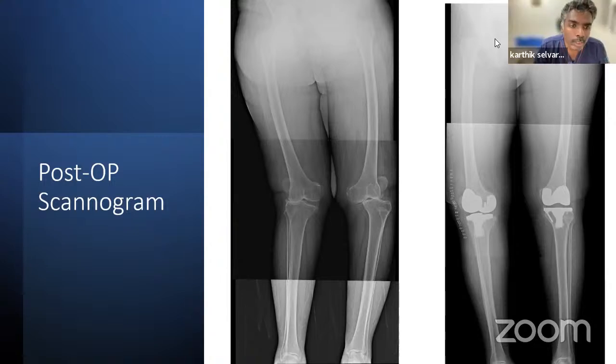You don't need to worry about torsion in tibia. I think we need not bother too much unless it is very severe. As I said, in varus, the torsional deformities will be less. You may have some tibia vara, but in valgus and some of the dysplastic valgus, there is a significant torsional deformity between proximal tibia and distal tibia. There is definite rotational deformity there. In those cases, you have a little bit of confusion how to exactly keep the tibial component dialed in for the proper rotation. And when you have got doubt, you keep it in slight external rotation. That's all.